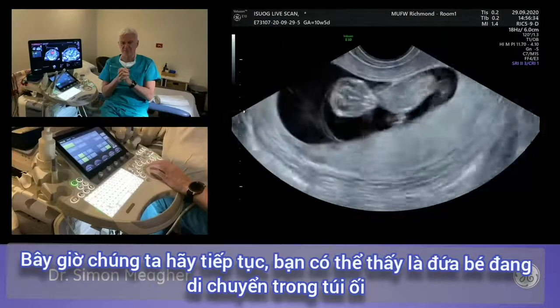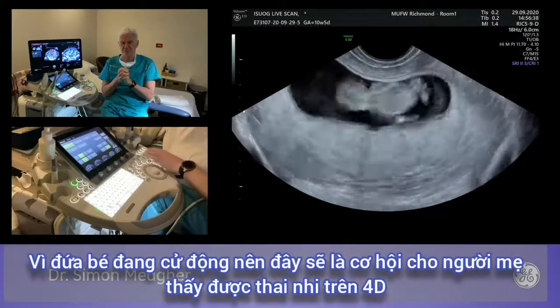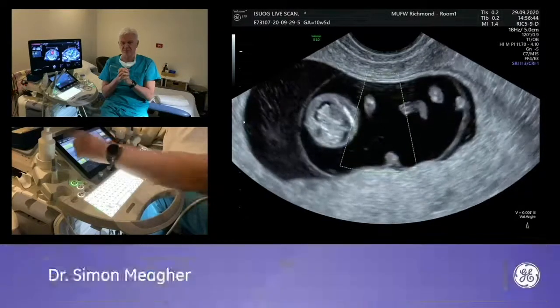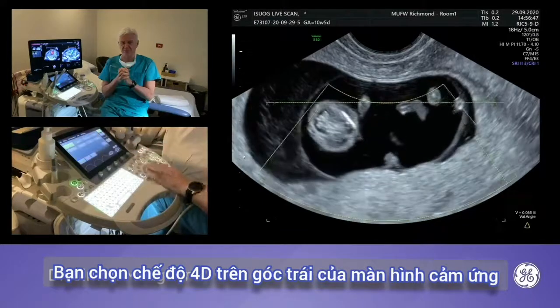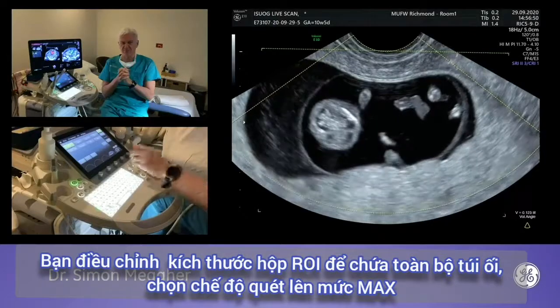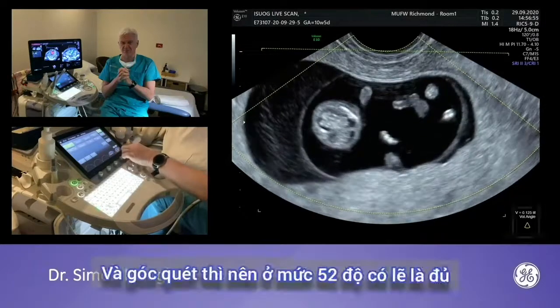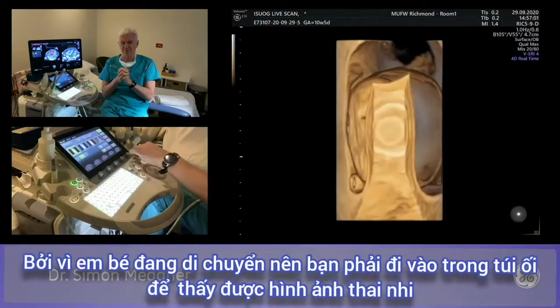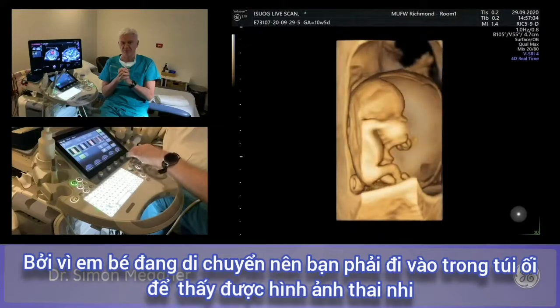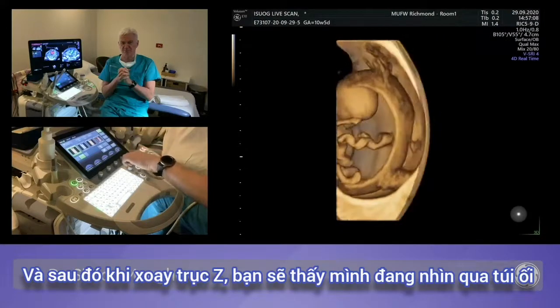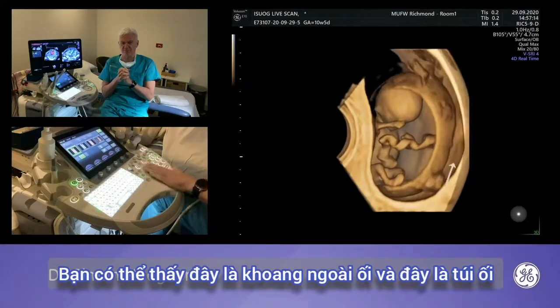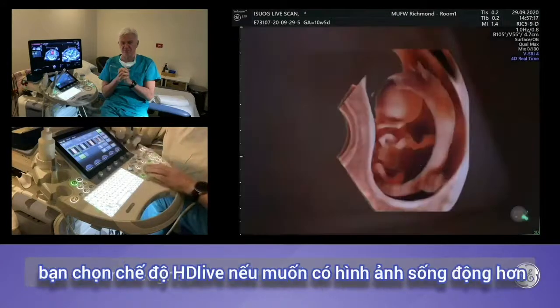The fetus is moving inside the amniotic sac, which is an opportunity for the mother to see the baby on real-time 3D. Selecting 4D, choosing the region of interest to include the amniotic sac, quality set to max, angle around 55 degrees. Translating through into the sac brings the fetus into view. With y-axis rotation, you can look through the amniotic sac and see the celomic space. Switching to HD Live rendering, adjusting the light source, you can see the umbilical cord coming out of the abdominal wall with multiple loops, then settling into the placental surface.